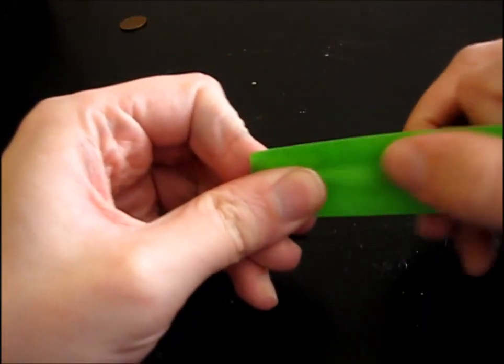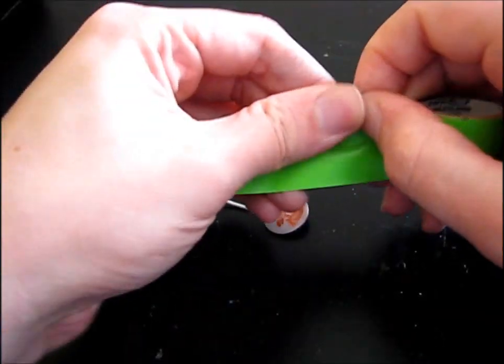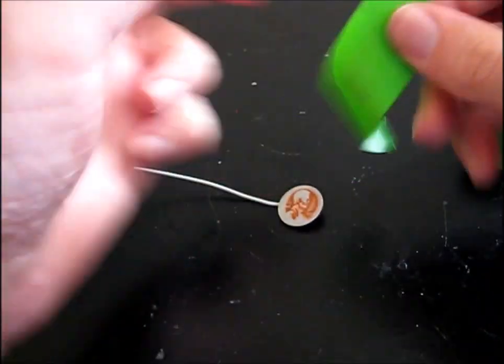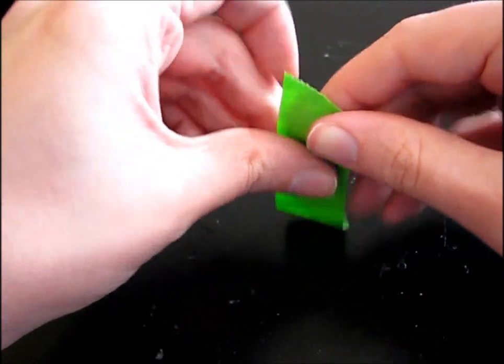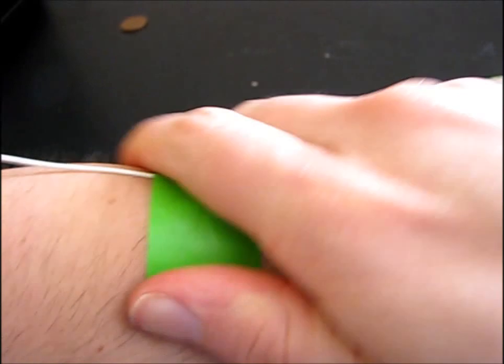To get the probe to stick, we're going to be using a little bit of painter's tape. Put that on the tail side and try to get as much surface area against the skin as possible.